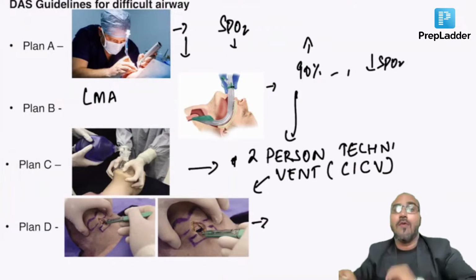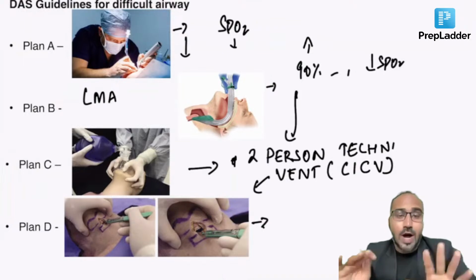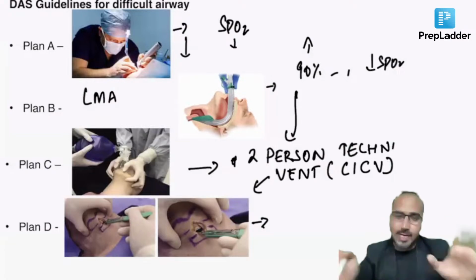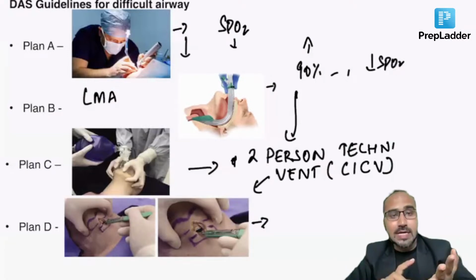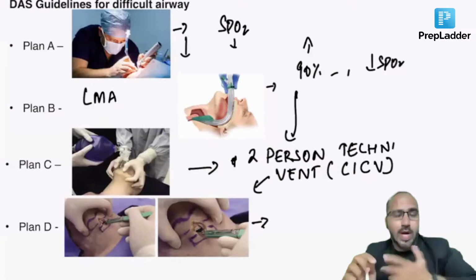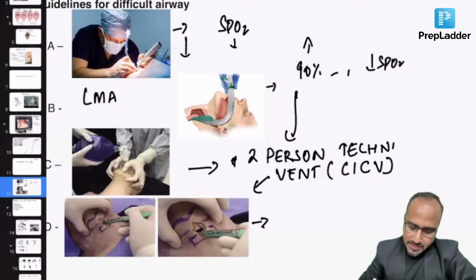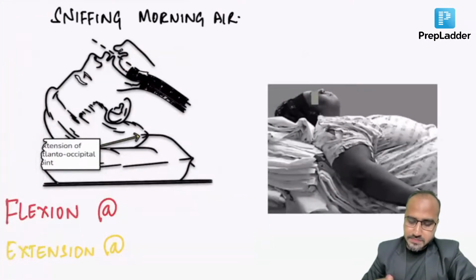Now, guys, for doing intubation, what are the things required? What is the positioning required? Again, it's in the picture. What are the instruments required? What tube is required? If you fail intubation, what is required? We'll discuss now. Okay, so look over here, guys.